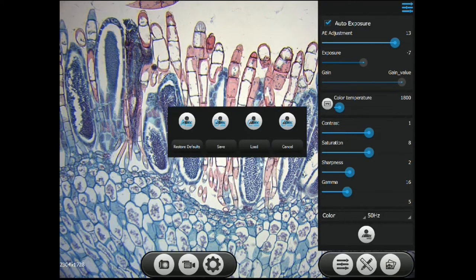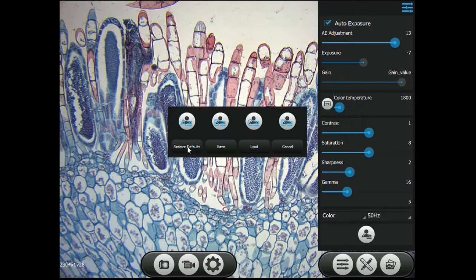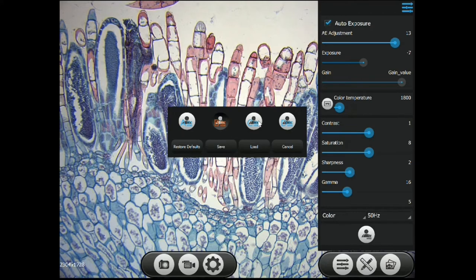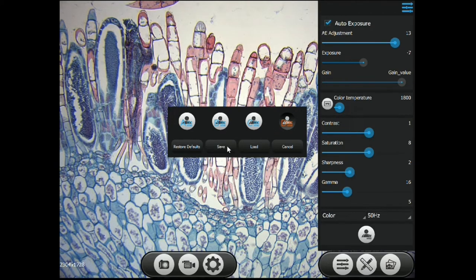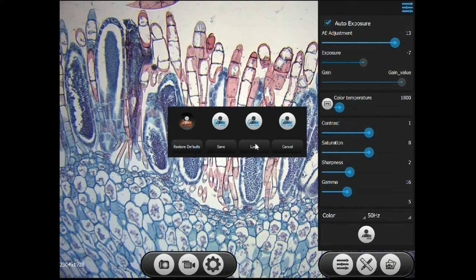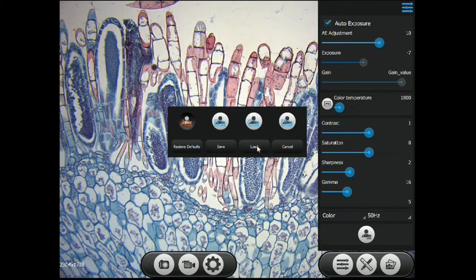To restore the camera settings to default, hit the restore default button. If you find a setting you like, feel free to save it into one of the user presets by selecting the user preset you would like and hitting save. To load a previously saved user preset, click on the preset you would like and hit load.